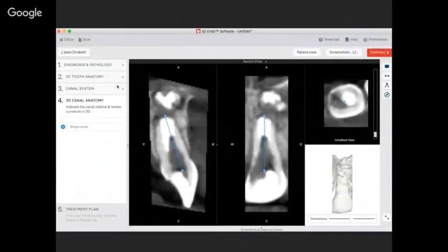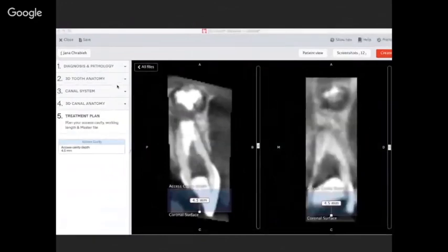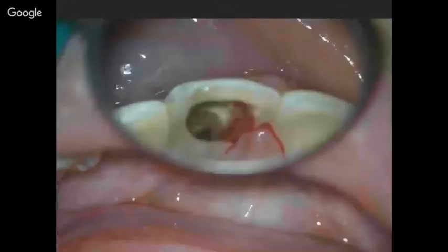So here it is. On the CBCT, I could determine the working length. I knew that I had to remove all the MTA from inside and from the outside, do it again, removing the extrusion of the MTA, closing the perforation due to the internal resorption, and hope for a better prognosis for the tooth. So this is the axis and the depth of the cavity. And in reality, when I removed the temporary dressing, I could see clinically under the microscope the location of the resorption and the extent of the resorption, exactly as I saw it on the CBCT.